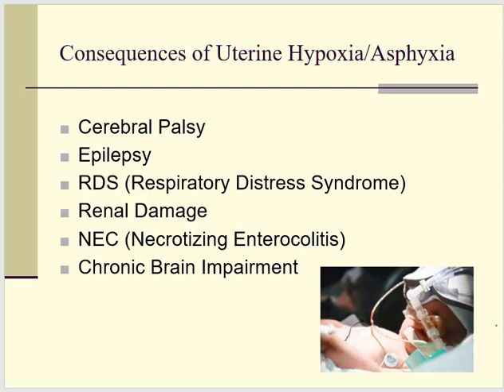So the object of fetal heart rate monitoring is to reduce the mortality and the morbidity by hopefully ensuring that all fetal hypoxic insults are identified in time to allow rescue of the baby, or maybe alter the reason for the lack of oxygen. Maybe we can fix it and continue with the pregnancy or the labor process.